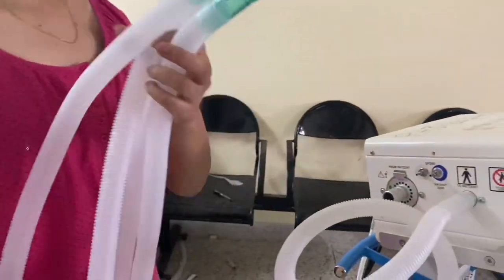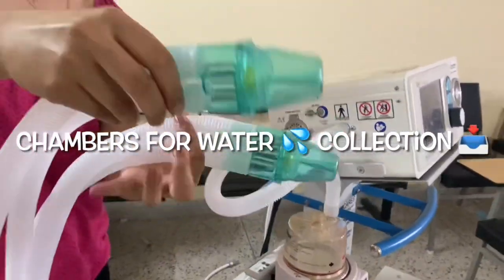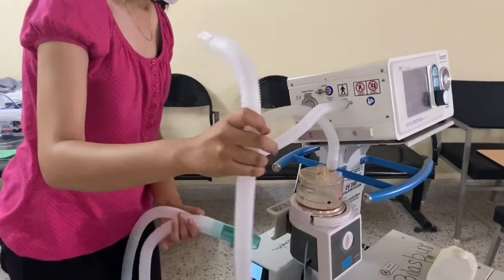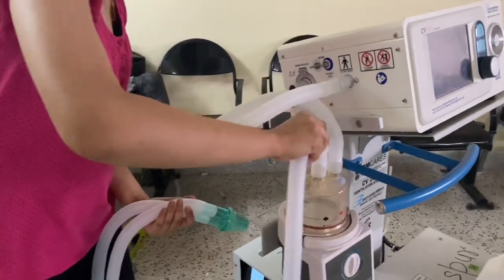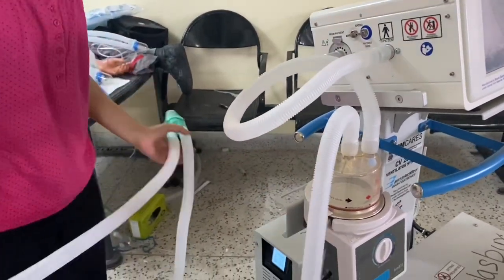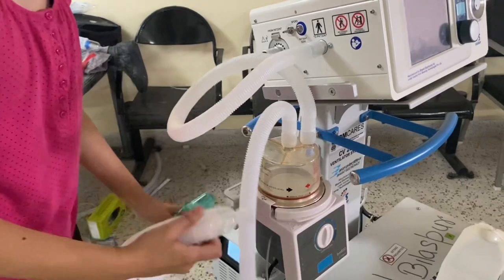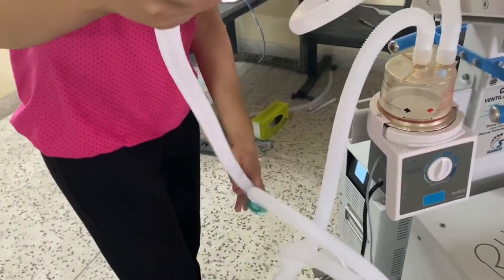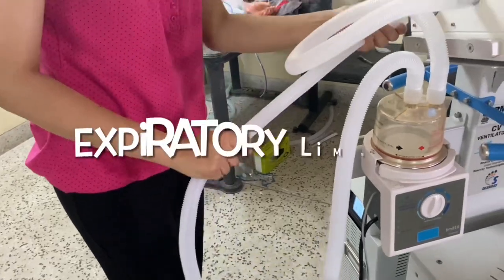Now let's attach the main circuit. Here you can see we have the water traps at the end — make sure they are closed tightly, else there will be a source of leak. Attach the free pipe to the humidifier, keeping the Y portion towards the patient. Next, attach the expiratory limb.